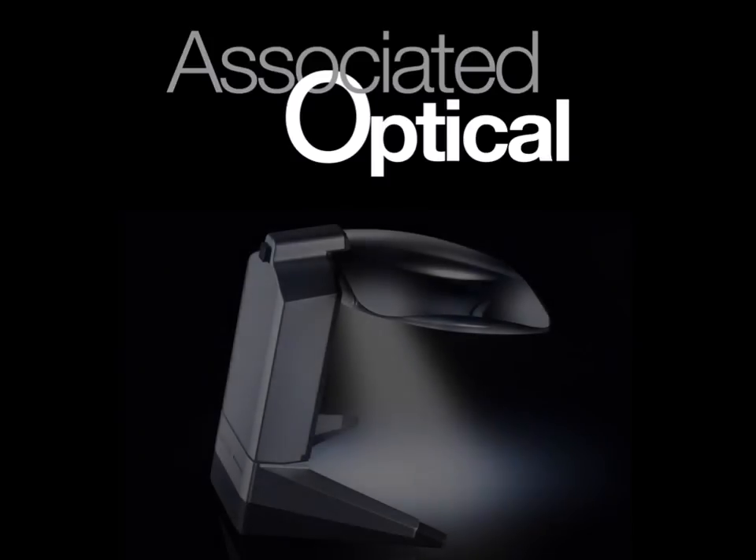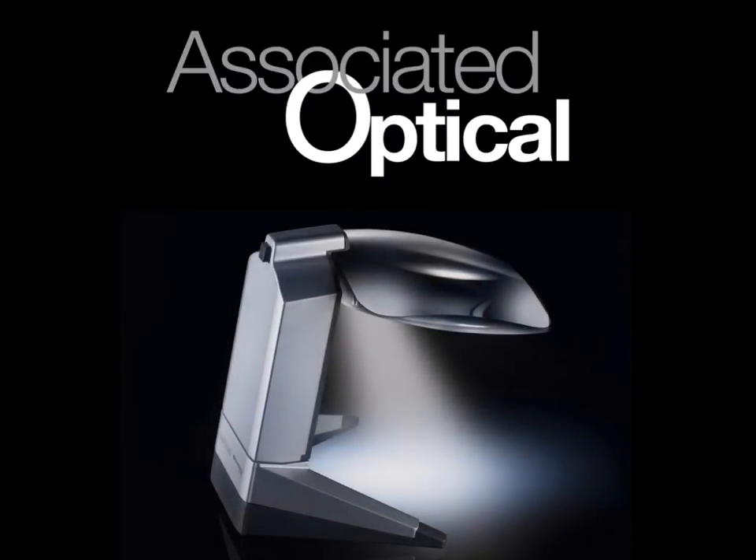Together, hand and stand magnifiers make up the majority of all optical low vision devices prescribed and sold. With such a diverse product range, stand magnifiers are often the device of first choice for those looking to achieve a hands-free viewing option. Thank you so much for watching.